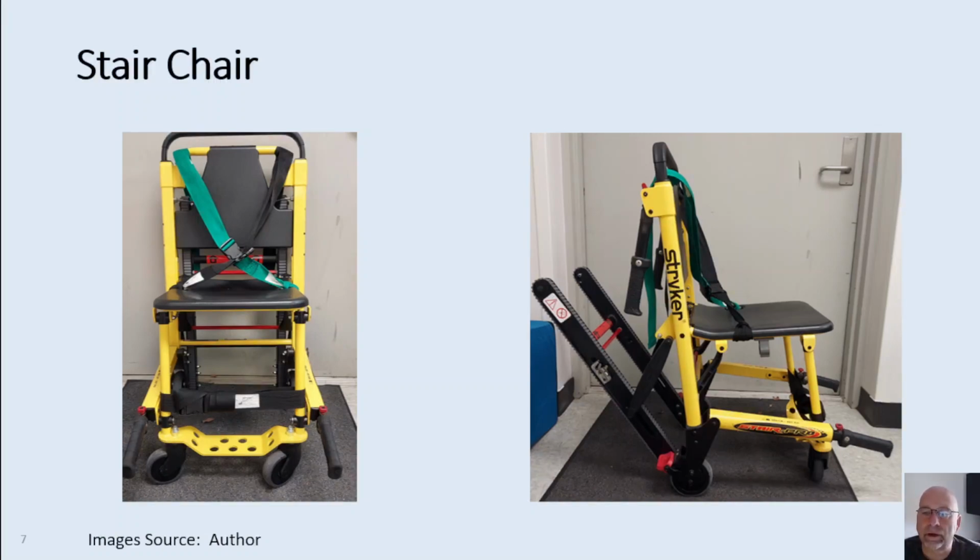Modern stair chairs come with a traction device that enables the stair chair to glide down the stairs rather than be carried over the stairs. There are even battery-powered stair chairs available to glide a patient up or down stairs. From the patient perspective, being moved in a stair chair can be quite scary. It's important that we communicate to the patient and let them know what we are doing before we do it. This will keep them from reaching out to grab the banister and throwing you and your partner off balance.